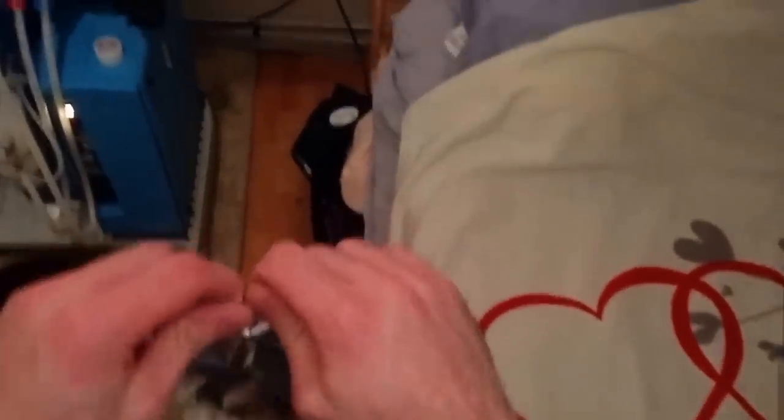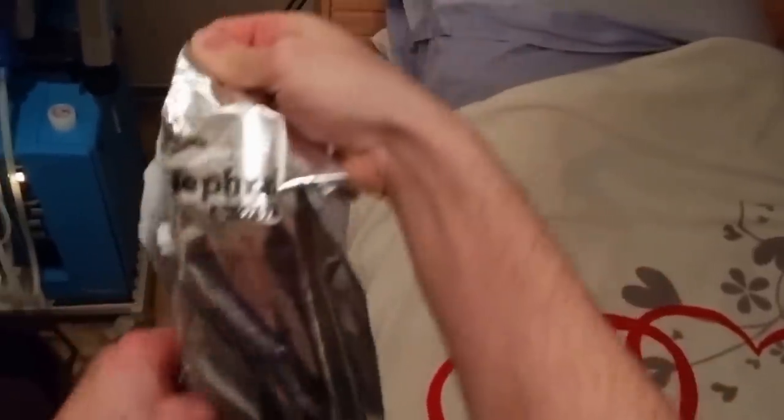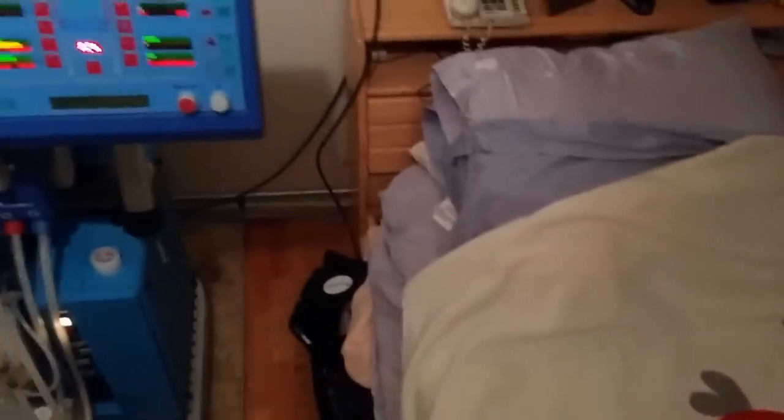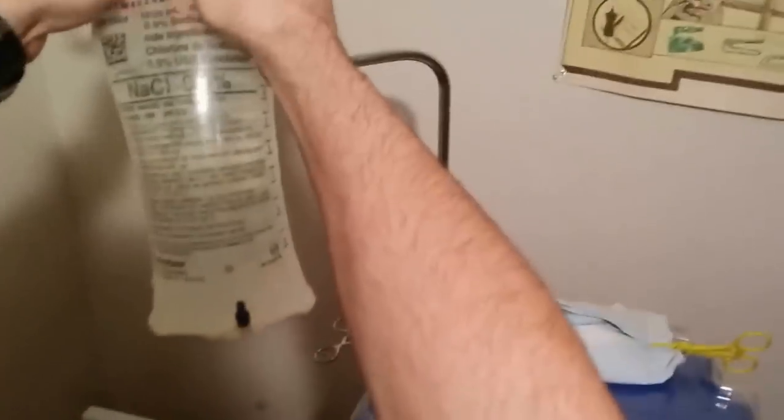We can go straight to lining the machine. In this package is what they call the dialyzer — it's basically the heart and soul of the dialysis machine, it does all the blood filtering, and it has four ports on it, so we connect that on the machine. This package contains the actual lines that go on the machine, also in sterile packaging. There's a little sticker with the package manufacturing number just in case there are quality issues. And then some saline — sodium chloride — large bags. We use those to prime the machine, which basically means get the lines filled with saline and circulating prior to connecting it to the patient.